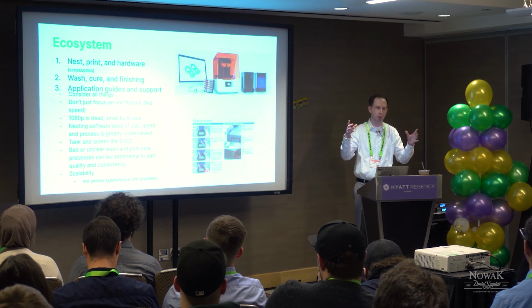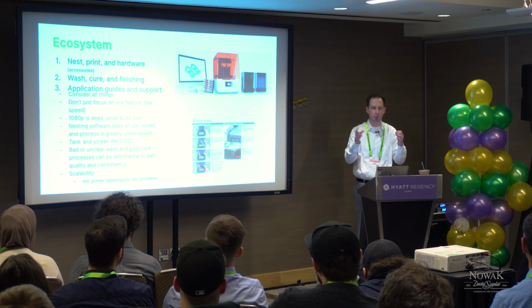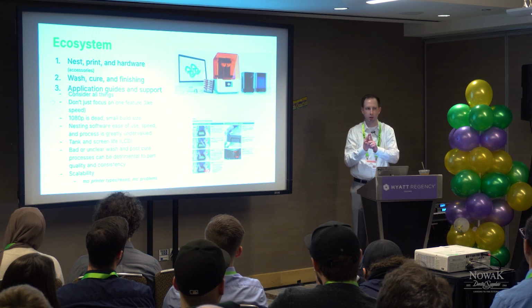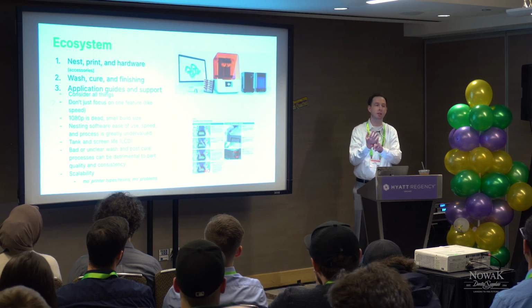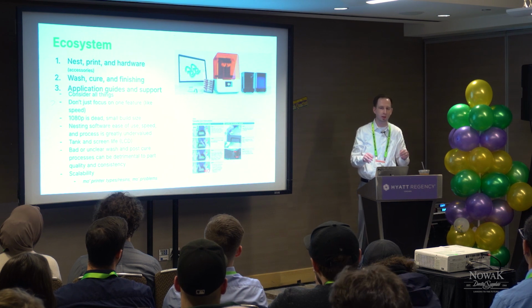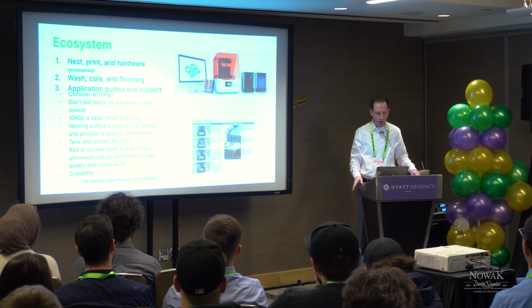They have a certain amount of hours to them. They're getting better, and I think this is probably going to be the technology of the future because it's so cheap per pixel in hardware versus DLP. But they need to be replaced. So it's not just about the life and how many parts you can get out of that life, but also how easy is it to replace? How expensive is it? Can you replace it without messing it up? It's like user replaceable things, but can the user actually? Can Linda replace it? Right? If my mom can replace it, we're in good shape.